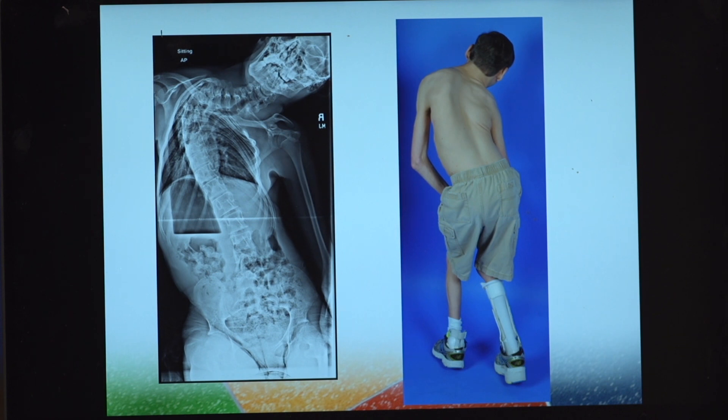This patient has severe neuromuscular scoliosis associated with the underlying diagnosis of cerebral palsy. This is the x-ray the patient presented with and this is the patient's presenting clinical photo. You can see significant trunk shift, significant shoulder asymmetry, and the prominence of the kyphoscoliosis represented in the x-ray.